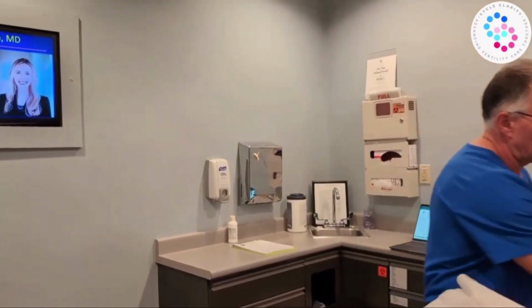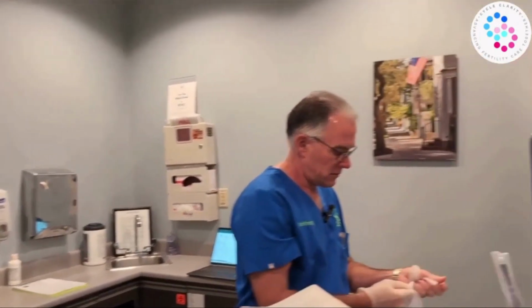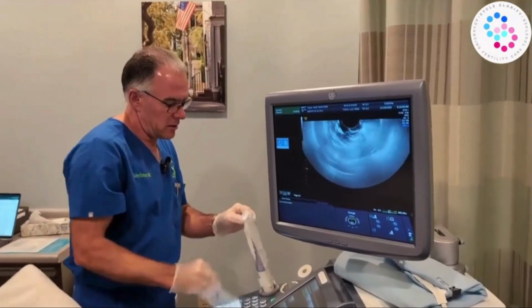You doing okay? All right. We'll slide on down. Let's get you set up. All right, let me get the ultrasound probe ready.